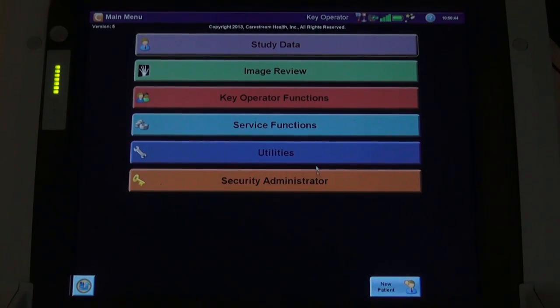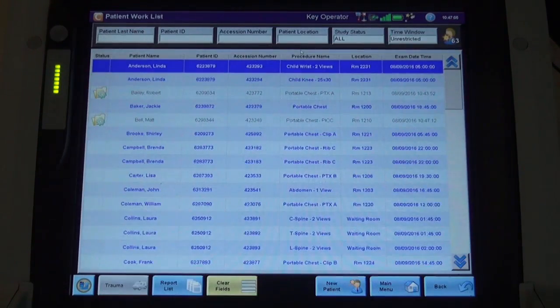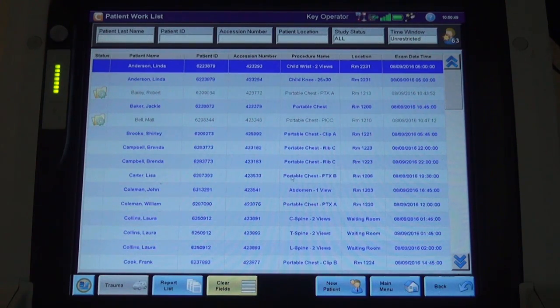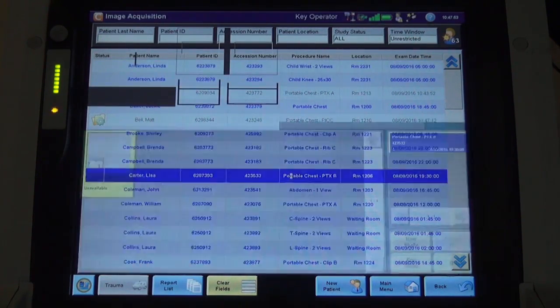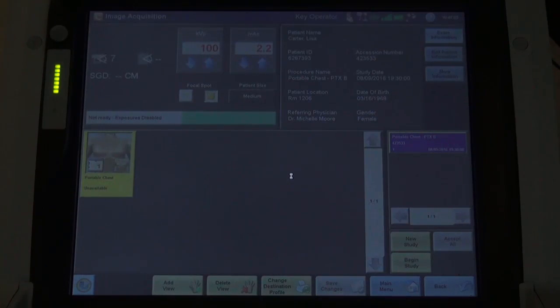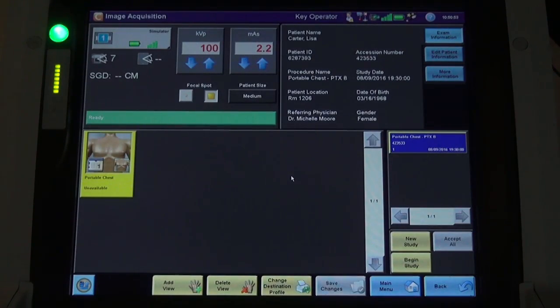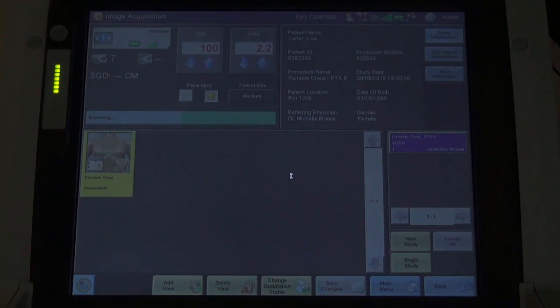Here is an example of the pneumothorax image processing on the CareStream DirectView software. We begin by selecting the patient from the modality worklist. After verifying the proper exposure factors, the radiographer captures the image.